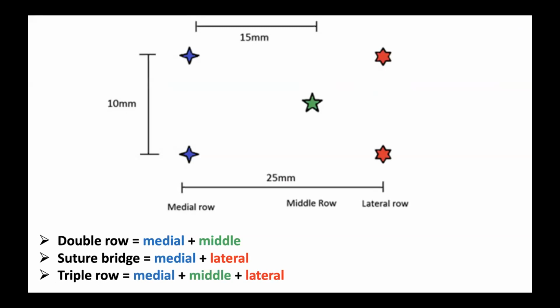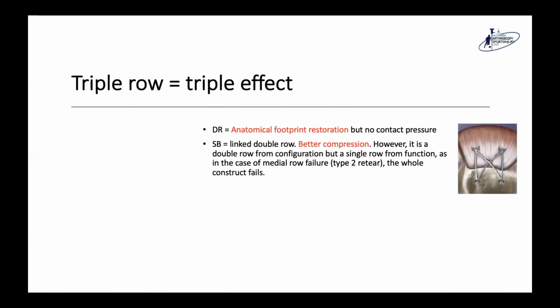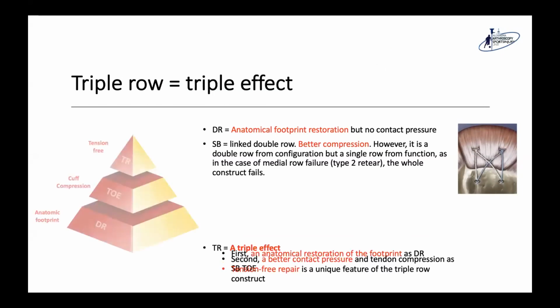You can realize here that the triple row is independent from both anchors. So why triple row? Because in the double row, you have anatomical footprint restoration, but no contact pressure. From here came the idea of the suture bridge technique that restores the footprint and does some compression at the rotator cuff to increase the healing.